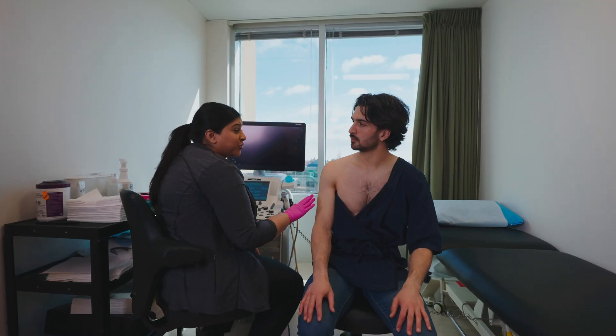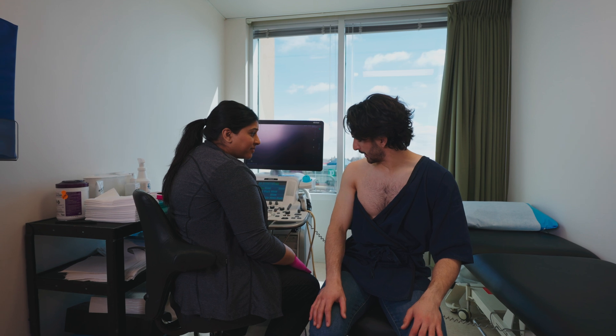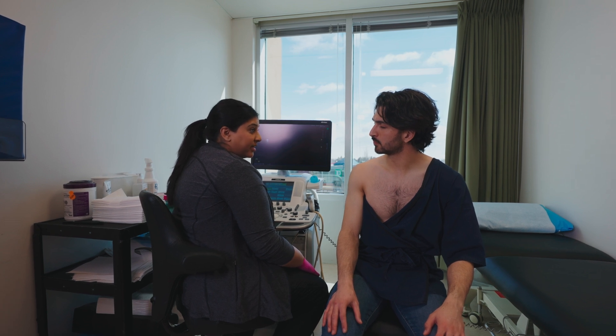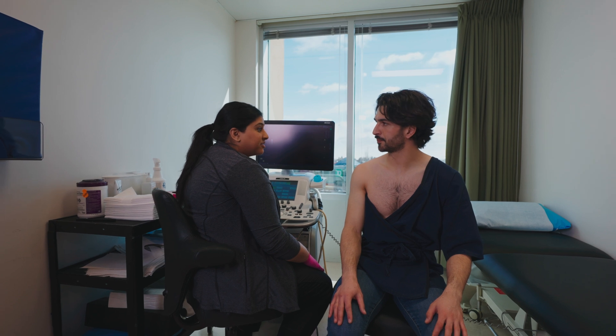So Marco, we're going to be looking at your right shoulder today. Do you want to tell me a little bit about what's happening? Yeah, just some pain for the last couple of weeks that hasn't really subsided, so I'm not really sure what's going on. Okay, so what we're going to do is we're going to take a look with the ultrasound today.